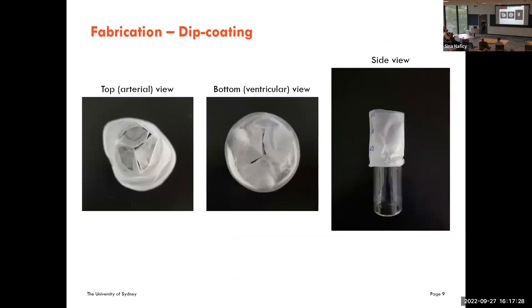After establishing the valve design, we make a mold that matches that design. We use dip coating for fabrication — taking the mold, dipping it in a polymer solution, letting it set, and carefully removing the mold. For this valve we also added a conduit around it, and you can see the result from the top, bottom, and side views. The material is quite thin, just like native heart valves.